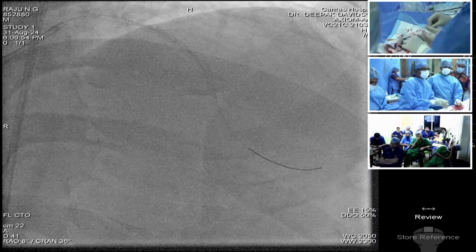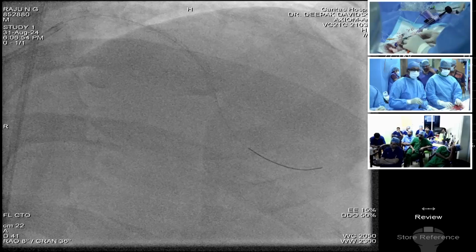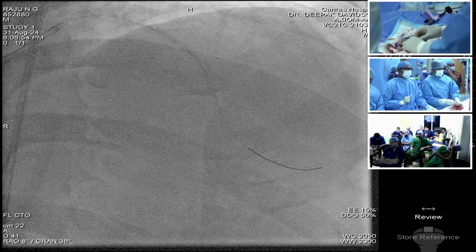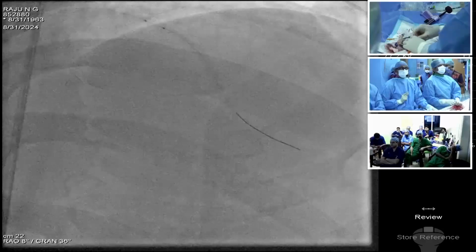We are going with a 2.5 for distal post dilatation, negative, yes. And then 3 proximal post dilatation. Then we'll do an OCT imaging from the left main to LAD and then decide what needs to be done for the circumflex left main LAD bifurcation. So the distally opening was good, but the proximal part. Yeah, proximal we dilate with 3 balloon. 3. Okay. Post dilate with 3 balloon.